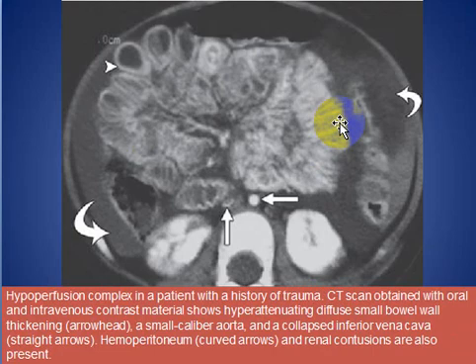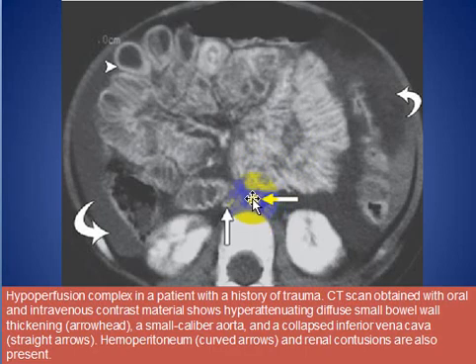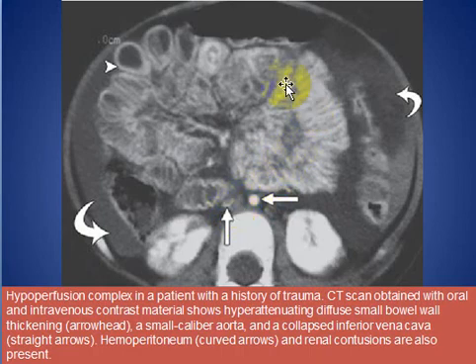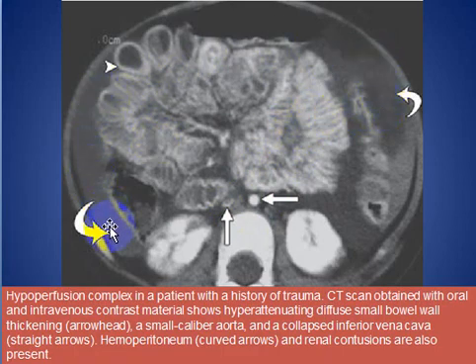Here we see hypoperfusion complex in a patient with a history of trauma. We see the aorta is markedly attenuated, the IVC is also attenuated, and there is hyperenhancement of the bowel wall associated with ascites.